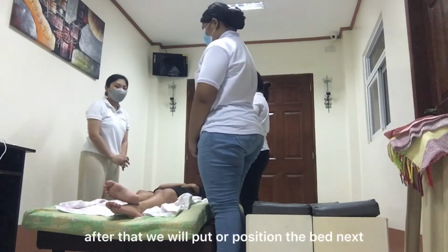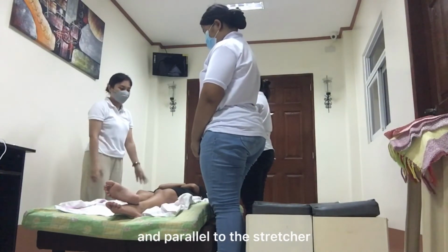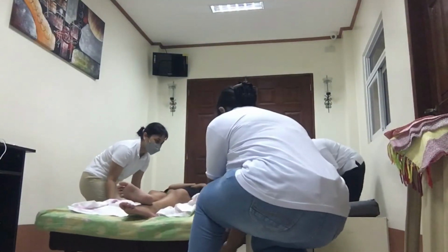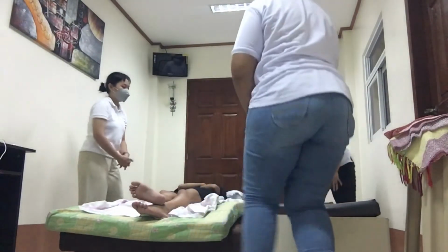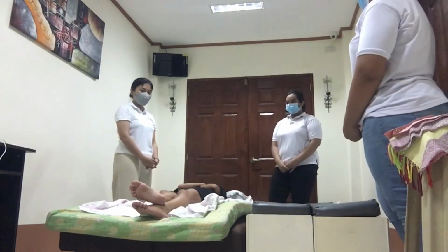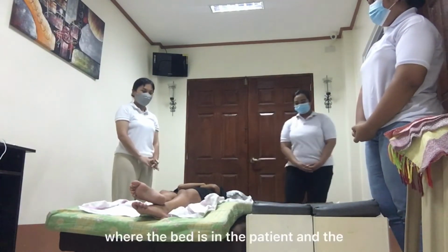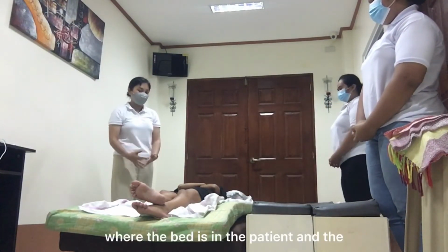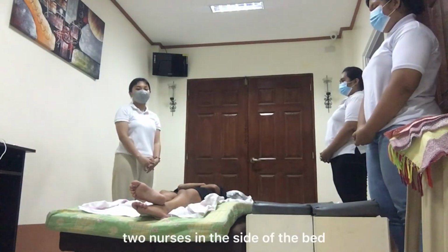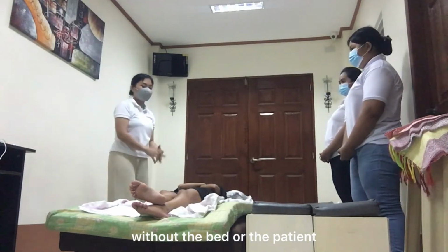After that, we will position the bed next to and parallel to the stretcher, and reposition the nurses appropriately. In the first, one nurse will stand on the side of the bed where the bed and the patient are, and the two nurses on the side without the bed or the patient.